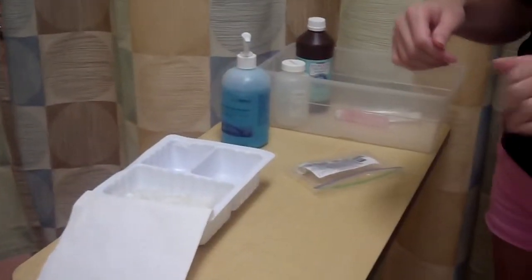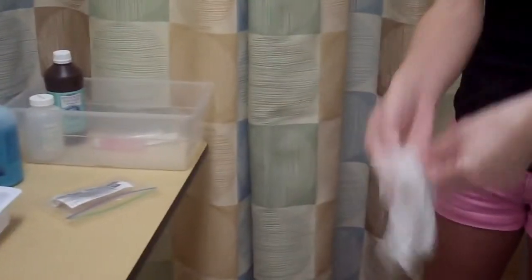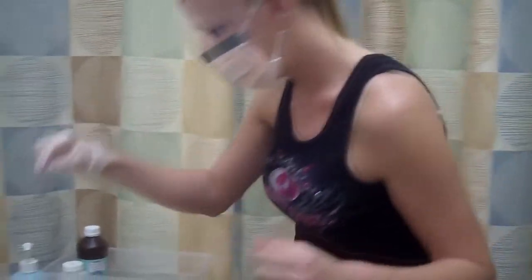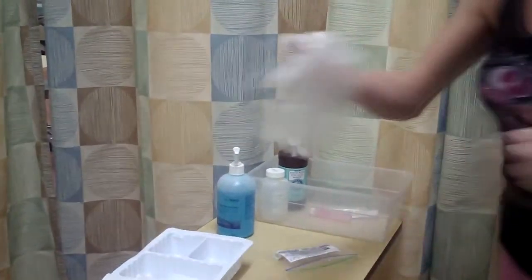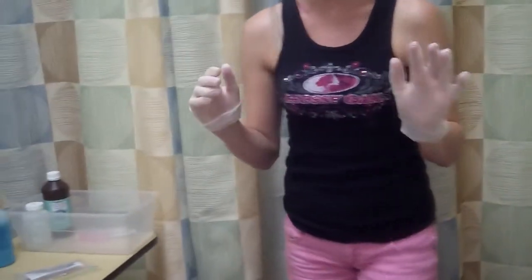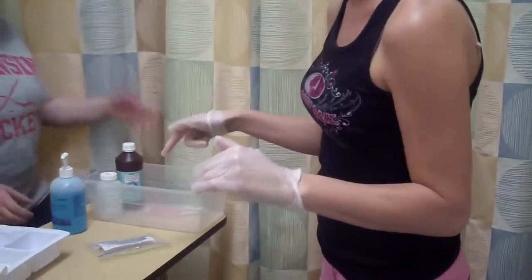Then I'm going to put on my sterile gloves. Picking up the first one, touching only the inside and removing it from my field. Put that on. Bring my other glove over. Put that one on as well. Then I'm going to ask for some help from Lisa to come over and open my inner cannula.